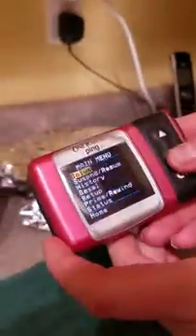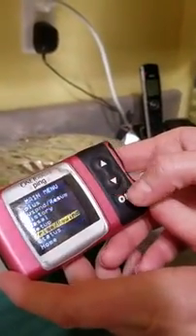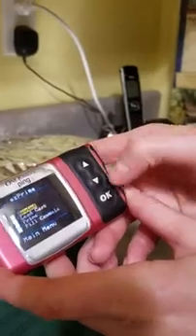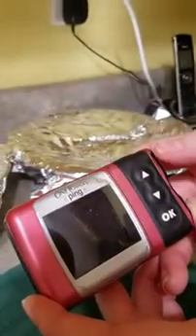I'm going to go to the main menu on the Animas One Touch. That's the kind of pump we have right now. And we're going to go to Prime Rewind. And we're going to hit OK on Rewind. And we're going to hit OK on Go Rewind.